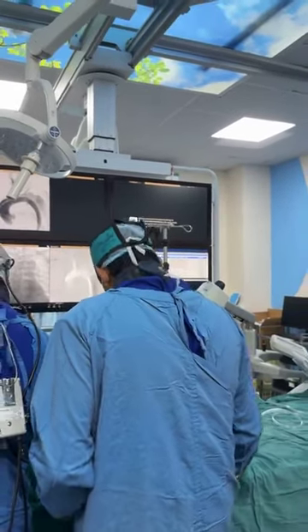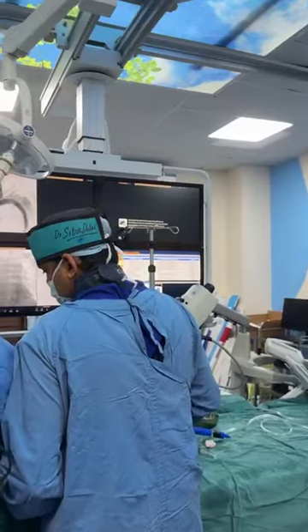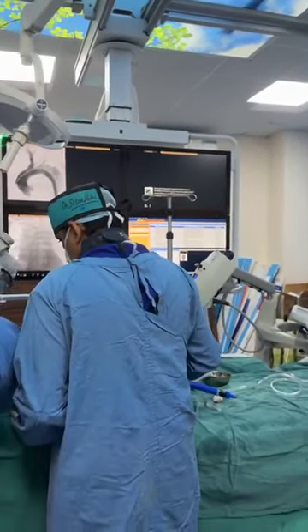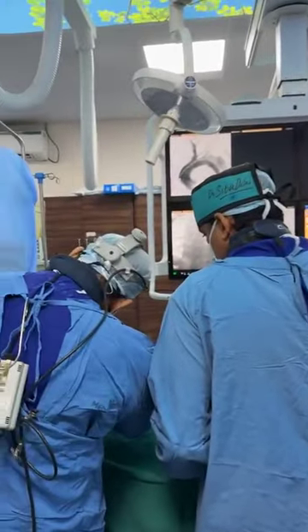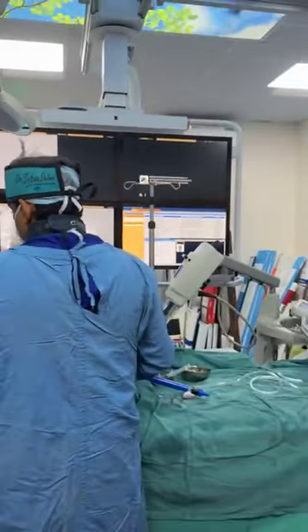Okay. Grand clamp cover. Wait. Should we give some heparin now? Heparin given, no? Give it. One more clamp.